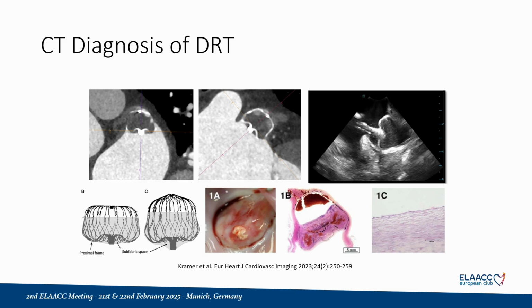I've brought a few cases, and first, the device-specific design that we look at is illustrated here on the Watchman device, where on the right-hand side you see the ICE images during the procedure, and you see that the device membrane is loosely bound to the device, so it creates an area or a cove, the subfabric space beneath the fabric.